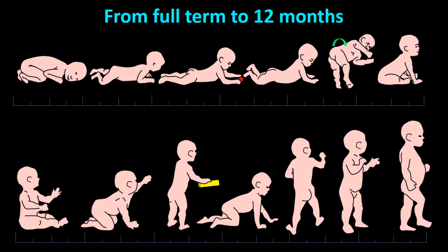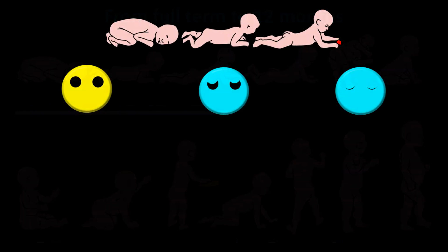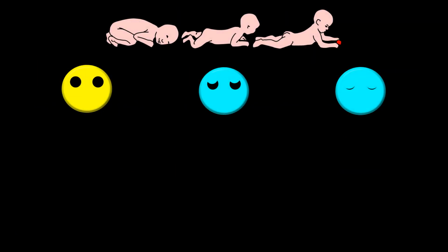Infants go through great developmental changes during the first year of life. Between 1 month and 12 months of age, they go from lying down to walking. In the first 3 months of life, an EEG of an infant may capture awake, drowsy, and sleep periods.